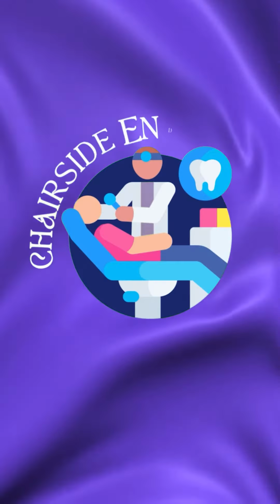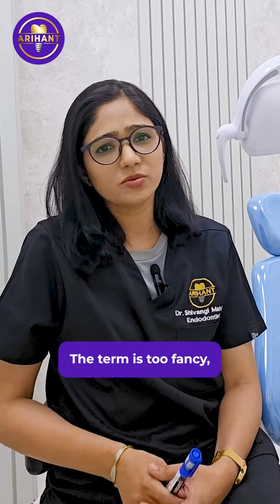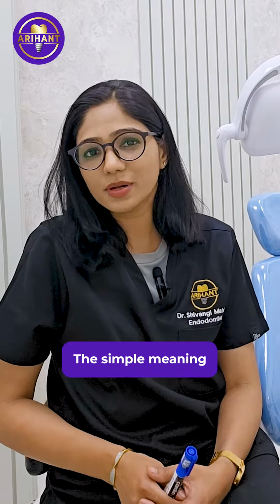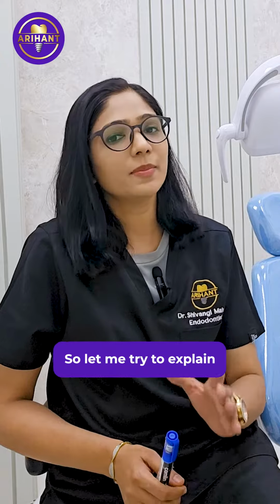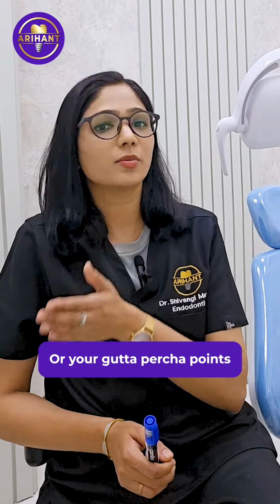Today's chairside endo topic is taper. A lot of students feel the term is too fancy and they fail to understand the simple meaning of the term taper. So let me try to explain taper. We usually come across this term in terms of your hand files, your rotary files, or your gutta-percha points.